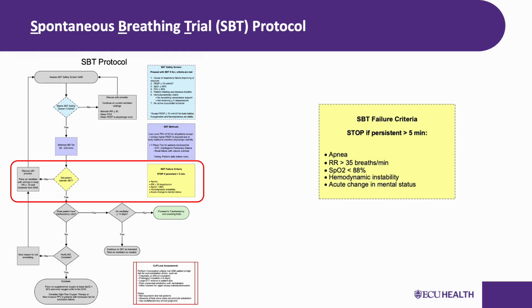Now, let us talk about what it looks like when an SBT is not going well. This slide covers the SBT failure criteria, and these are the red flags that tell you to stop the trial and return the patient to full ventilatory support or back to prior support. Look at the failure criteria listed on the flowchart. There are several key indicators you are monitoring throughout this trial period.